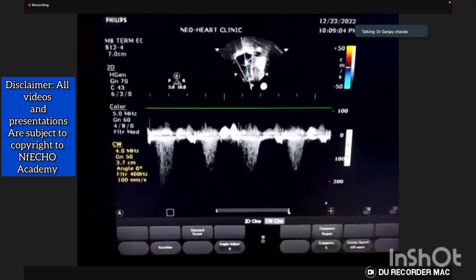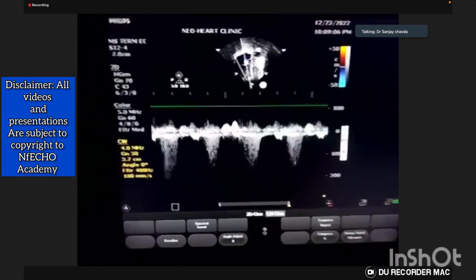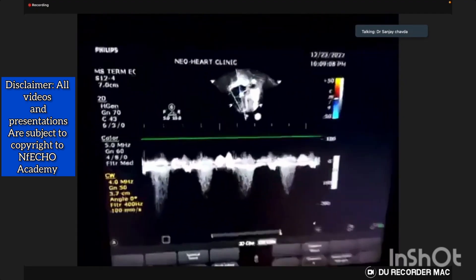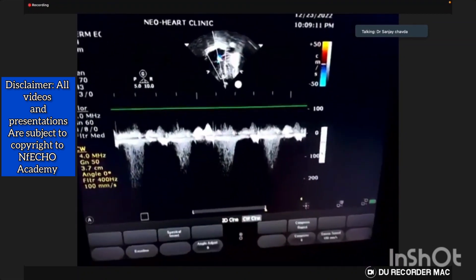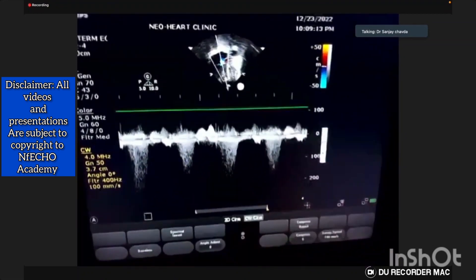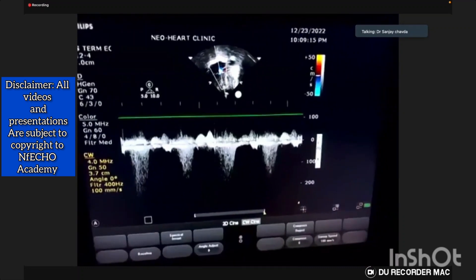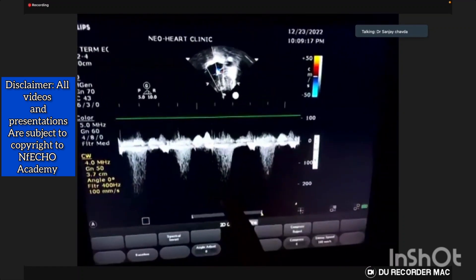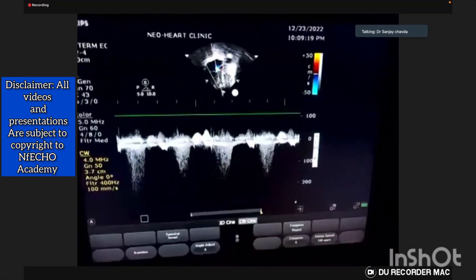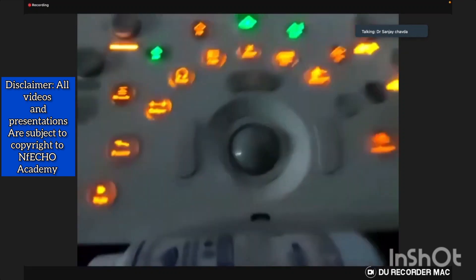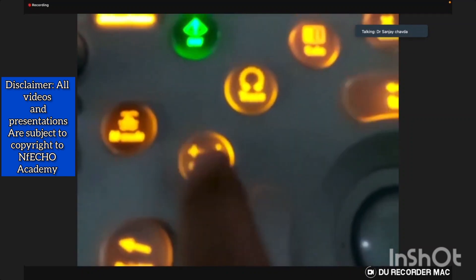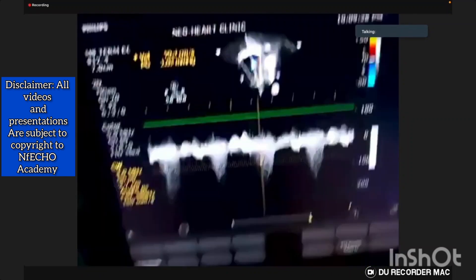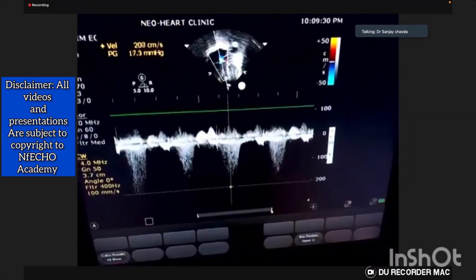We press the caliper button and look for the maximum velocity among all the traces. We press the caliper button to calculate the pressure gradient, and to that pressure gradient we add 6 to 10 mmHg. After pressing the caliper button, we are able to calculate the maximum velocity and therefore the estimated right ventricular pressure.